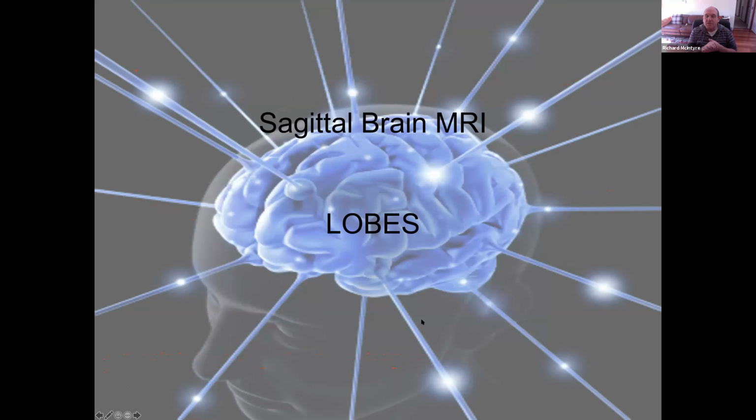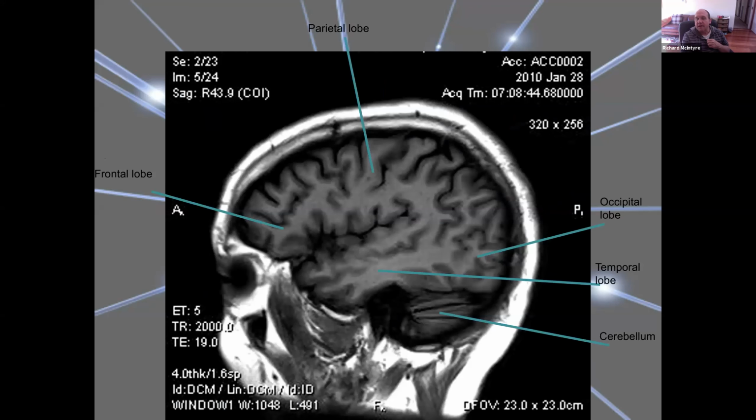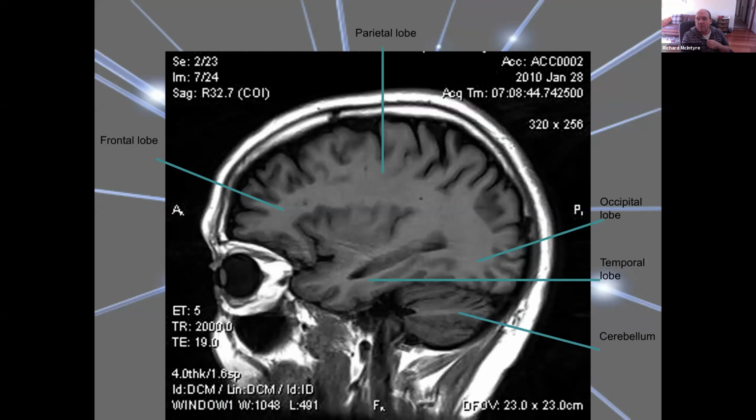Okay, so axial scans are the main part when we look at a brain. I think the doctors would spend most of their attention on axial images, certainly for the actual brain structure. Having said that, sagittal images definitely play a part, as do coronal images for a lot of the imaging.